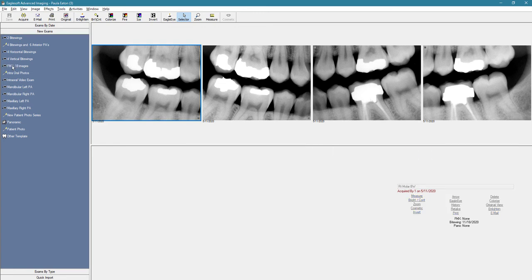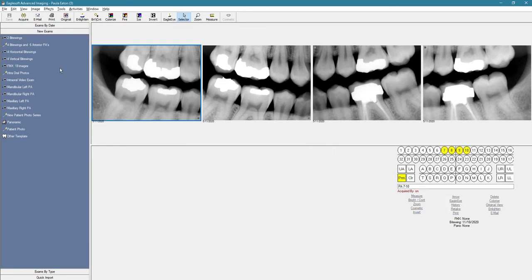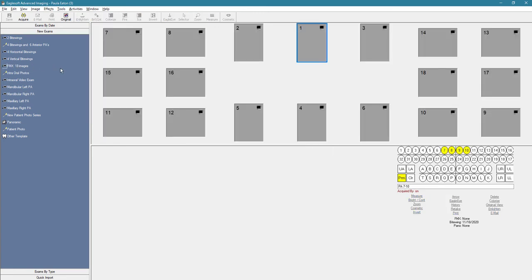And once we plug our sensor in, this number one box is going to be flashing in blue and yellow, and that tells you that it's ready to acquire an image. And at that point, you just need to place the x-ray sensor in the patient's mouth, position the x-ray tube head, and activate the exposure.